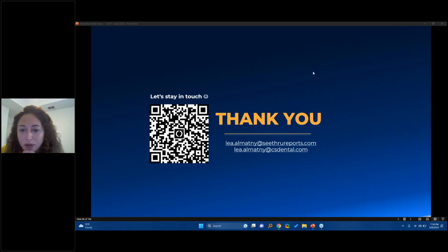What is the name of the software you recommended? It was the Carestream imaging software. If you go to carestreamdental.com, you can download the software from there, or if you know your local rep, they can also send it to you.